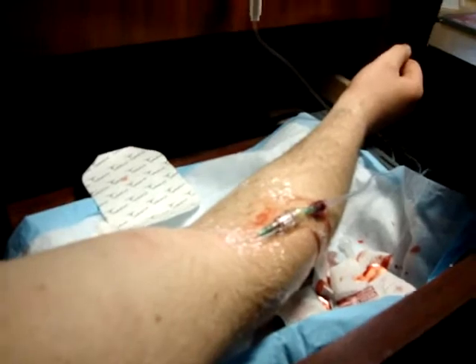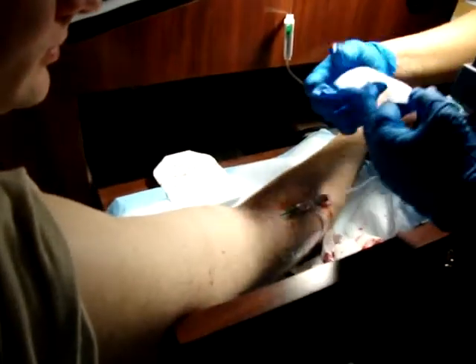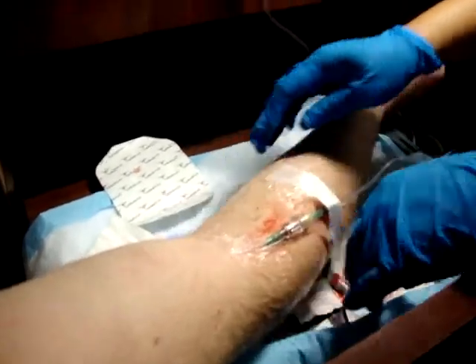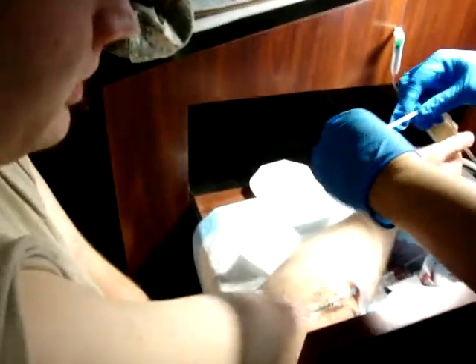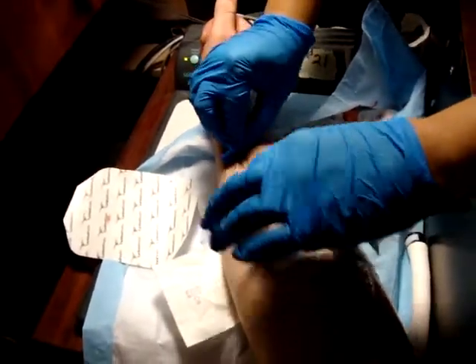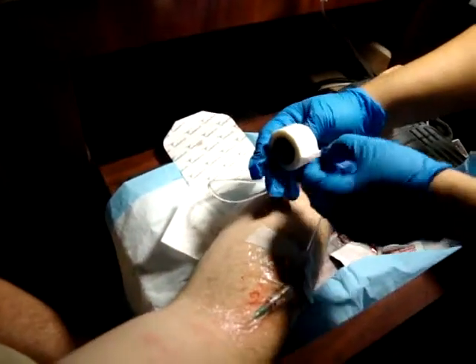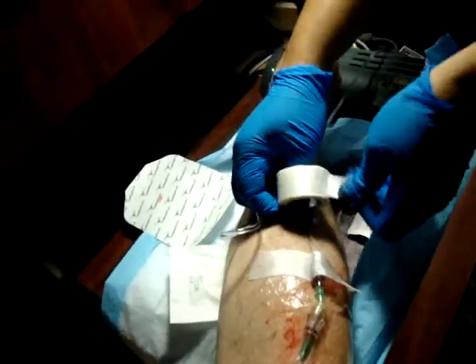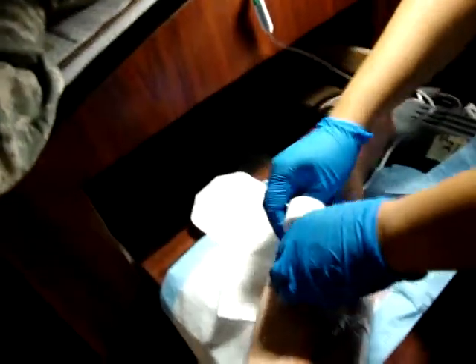Now, this is what's going to suck for Ilya — I have to tape it. The first thing you want to do is get one piece of tape to stabilize the tubing, probably right about here. Then go ahead and back your arm out. You're going to take the tubing and make an S with the tubing. Then take your tape and perform a barber pole with the tape.